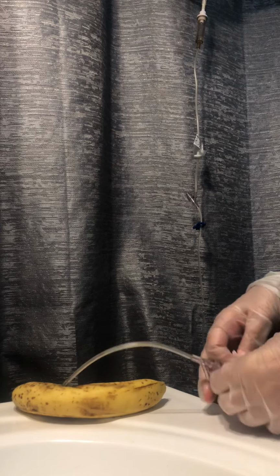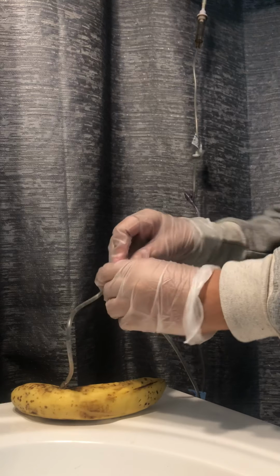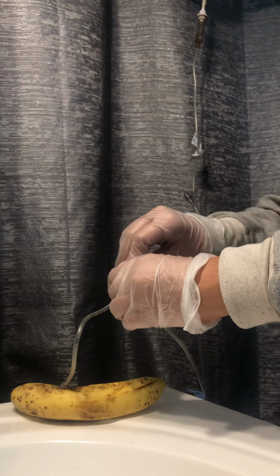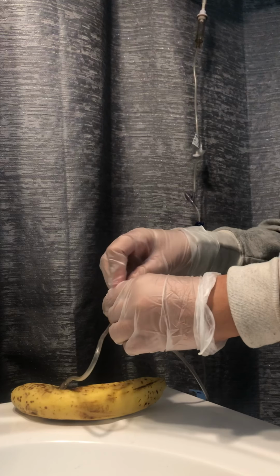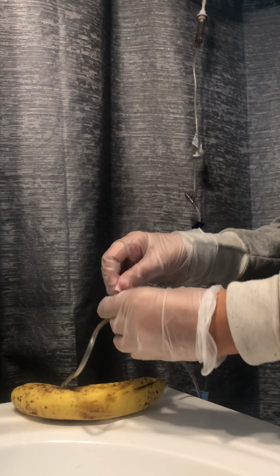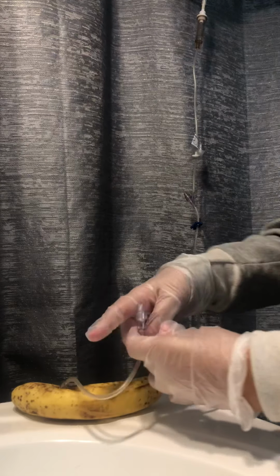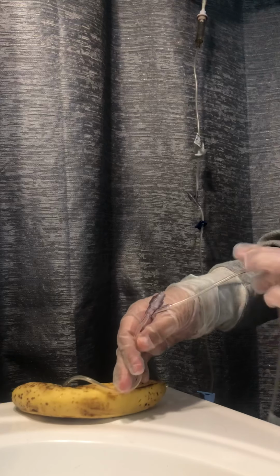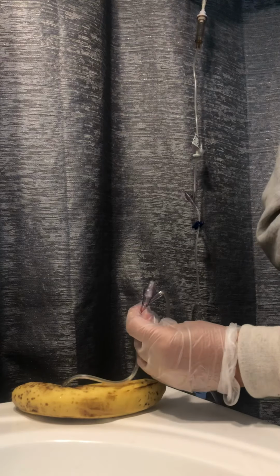Okay, so again, we're going to clean off the lower port again. Remember, we're going to do the 0.5 in 30 seconds. That's the math we figured out before we started. The difference between this one is that we're going to hold the pinch the whole time, while watching the clock, the second hand.